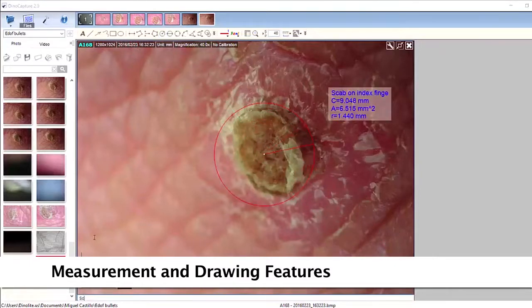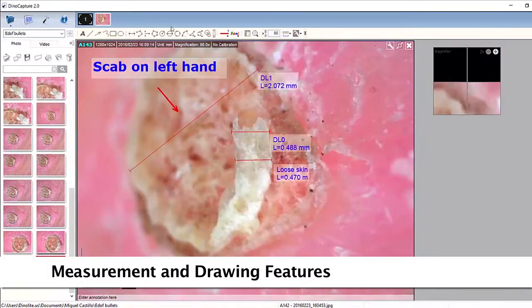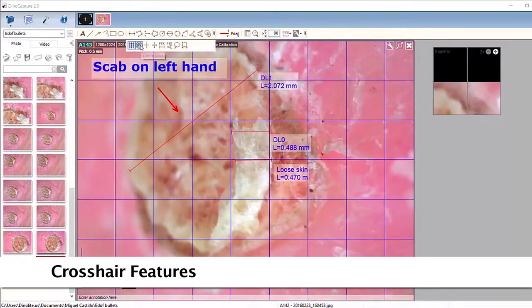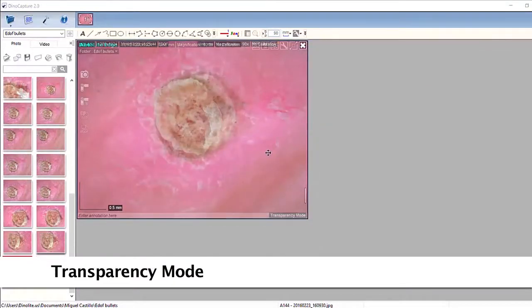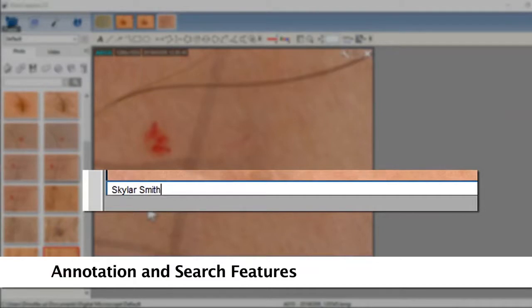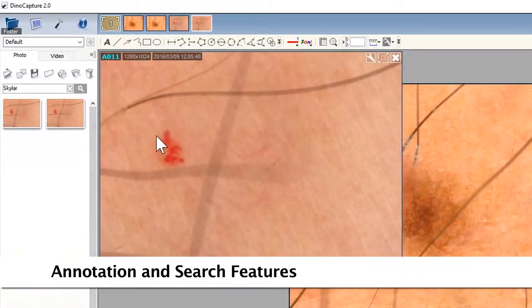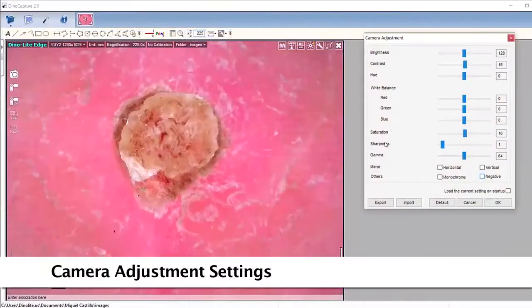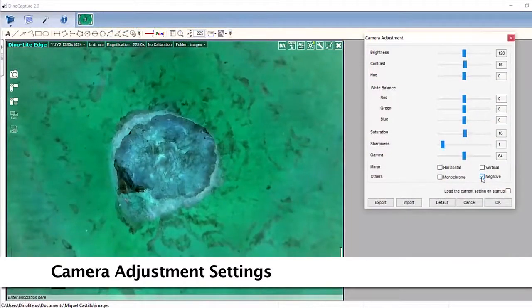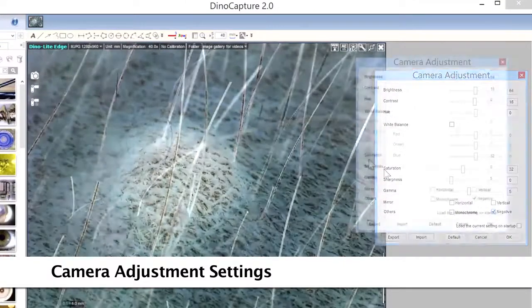The included software has measurement tools for compatible measurement models, as well as drawing annotation tools, crosshair features, and transparency modes. Some adjustable camera options include white balance, brightness, contrast, hue, as well as negative and monochrome modes and more.